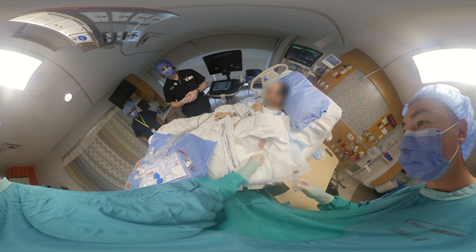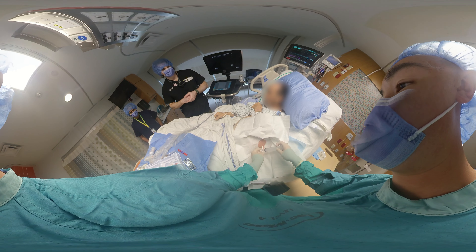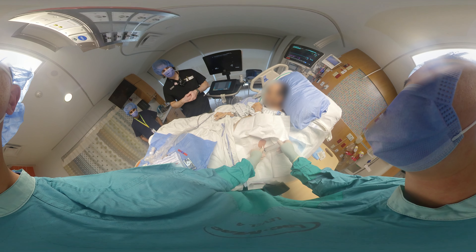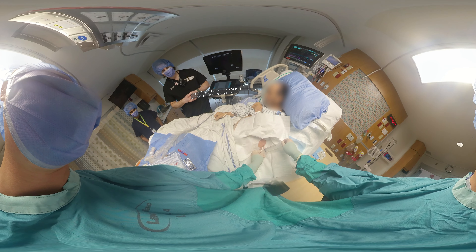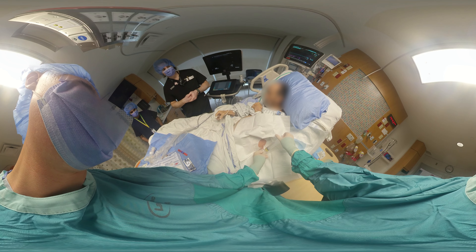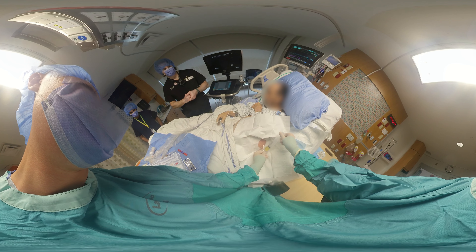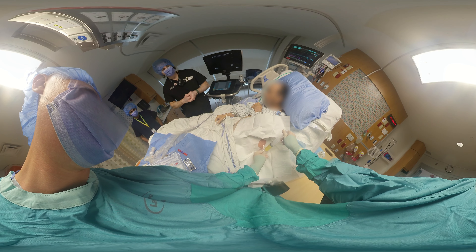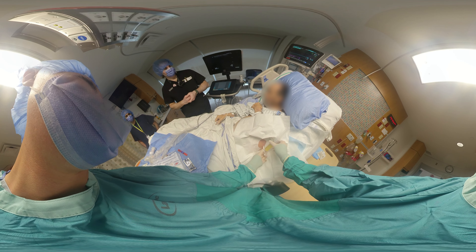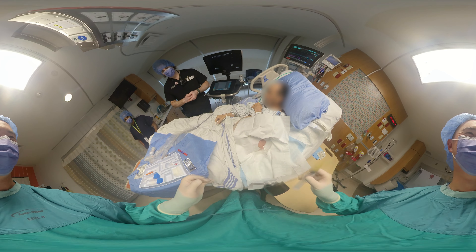Keep your hand fixed so the needle isn't advancing. The catheter is now in the peritoneal space, allowing for drainage and sample collection. Turn the stopcock towards you to allow for aspiration. We can collect fluid for diagnostic purposes — about 30 to 40 mls — and then connect up to a drainage bag to allow for a more therapeutic paracentesis.